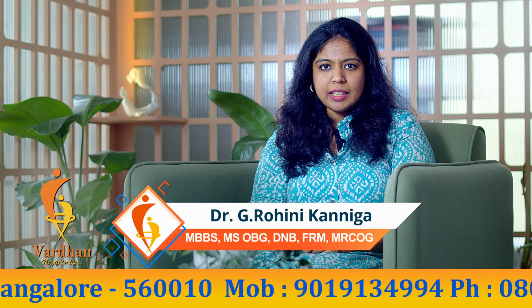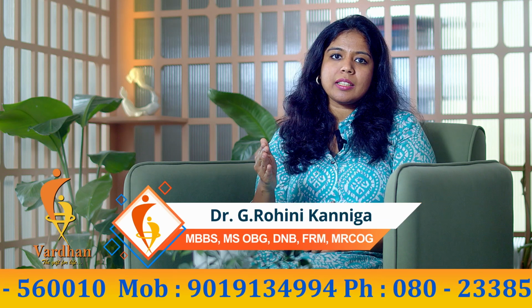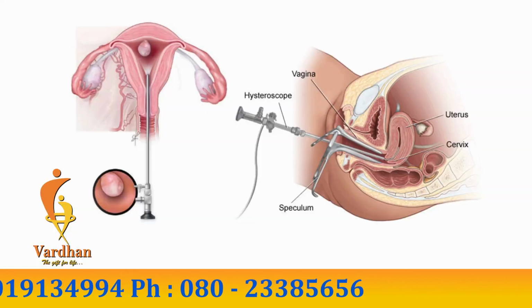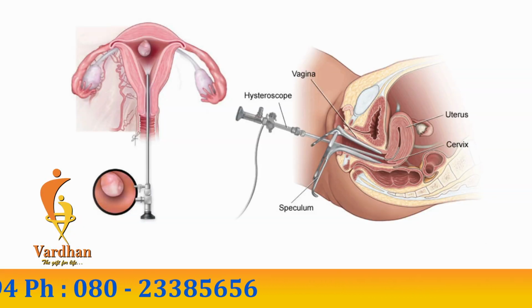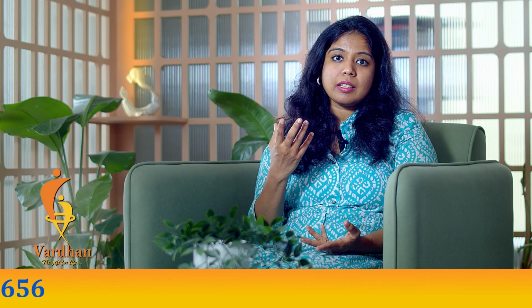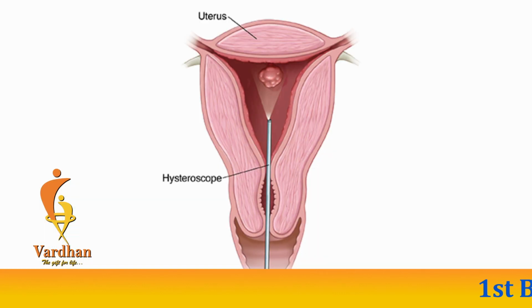And in case we find any abnormality, at the same time we can address that abnormality and convert this procedure into an operative procedure. So in case we see a cavity distorting fibroid or a polyp or any abnormal tissue which we feel may be cancerous, those tissues can be removed at the same time during the procedure.